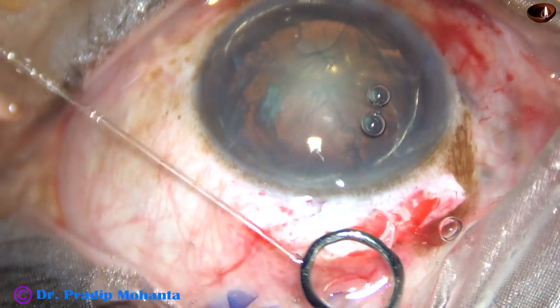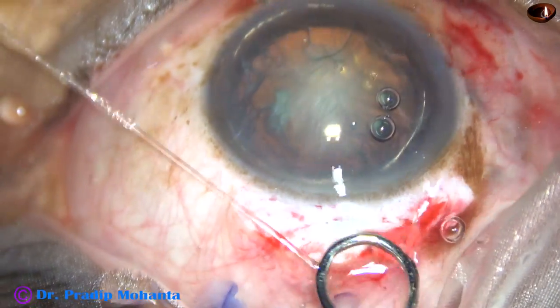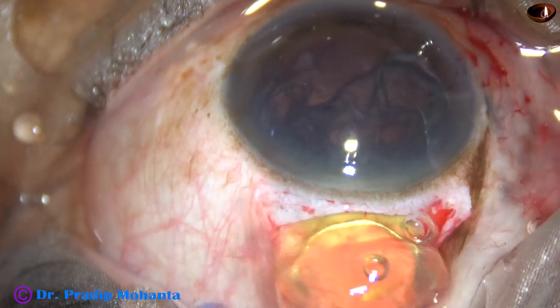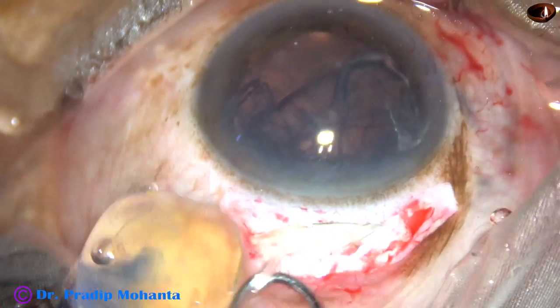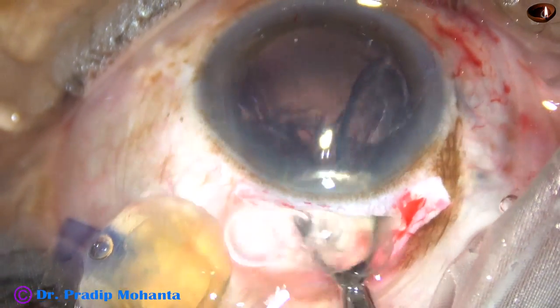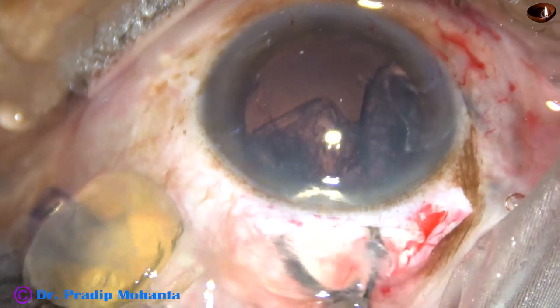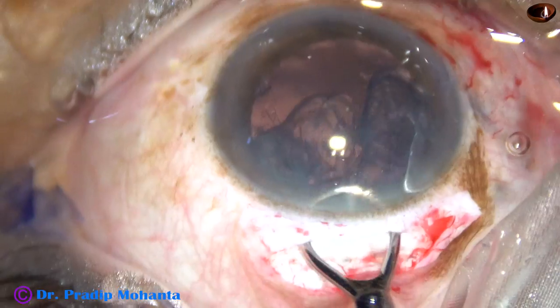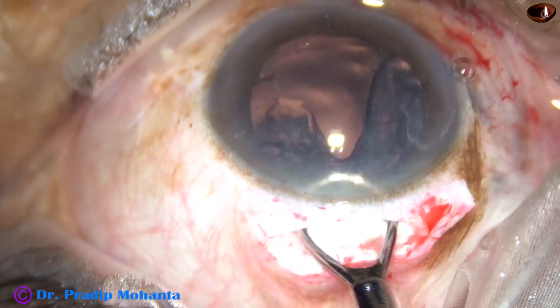This is an irrigating vectus. It is placed behind the nucleus and the posterior lip is depressed. The left hand holds the superior rectus bridal suture and the nucleus is gently delivered. Some portion of the epinucleus also comes out.